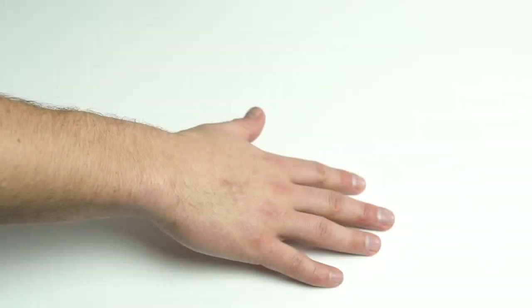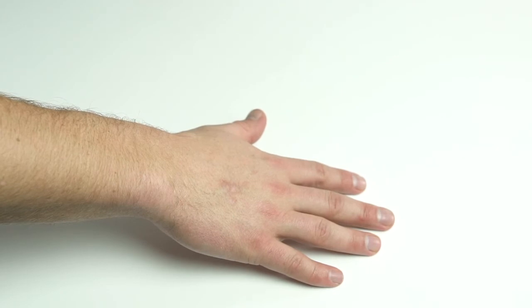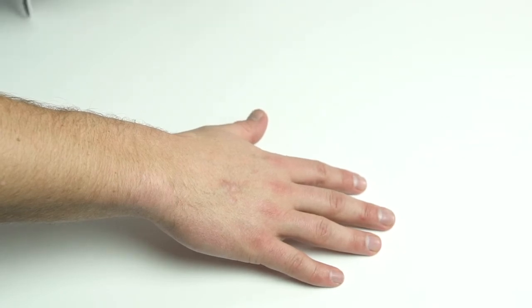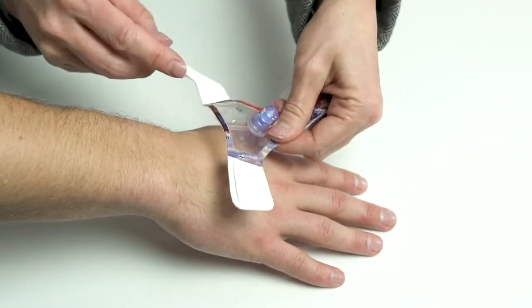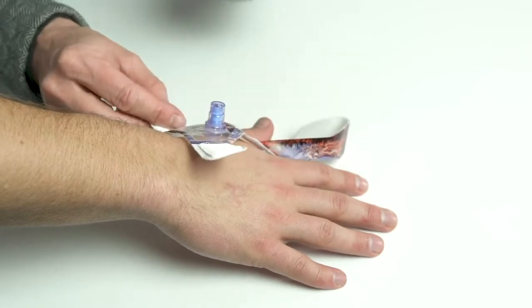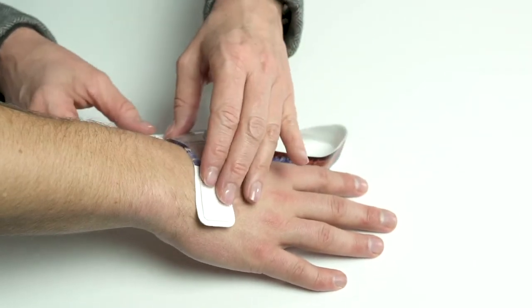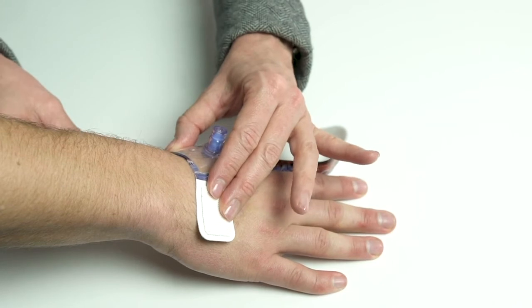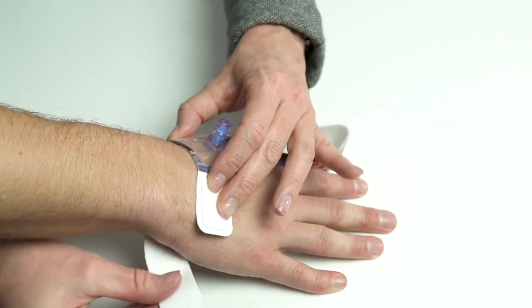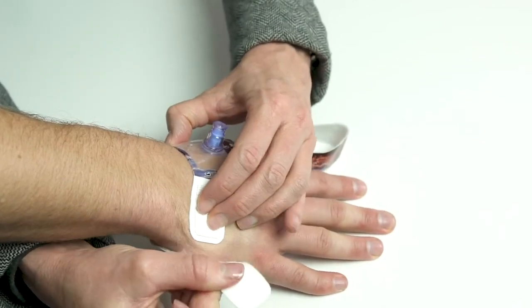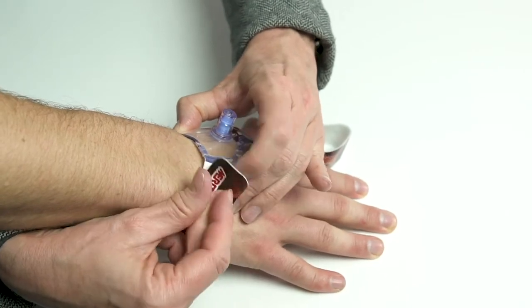We wanted to take a minute and show you some things that we've learned. I'm going to show you the way that we want them to place it. Band one goes to the pinky side. As we place it on top of our arteriotomy, we want to be sure that the physician braces the backer plate on each side as they pull and tighten the second band.